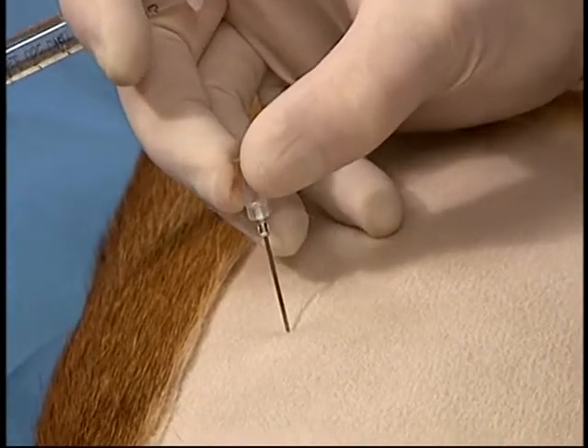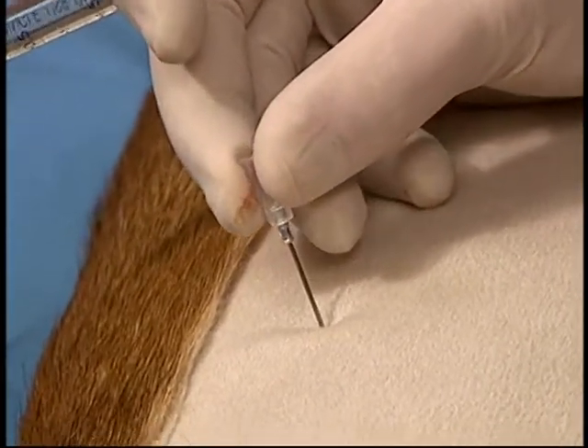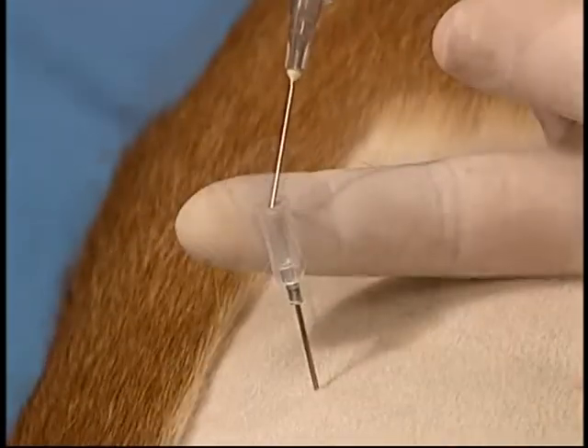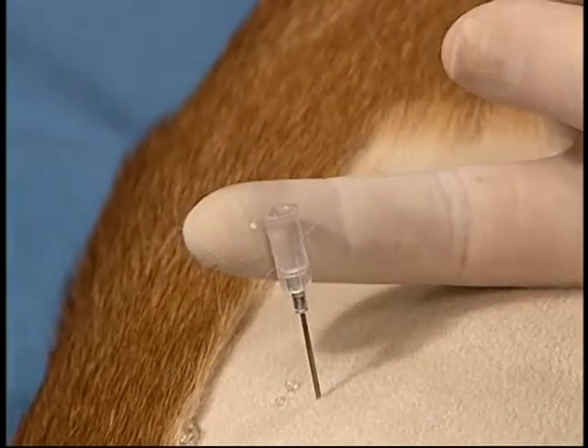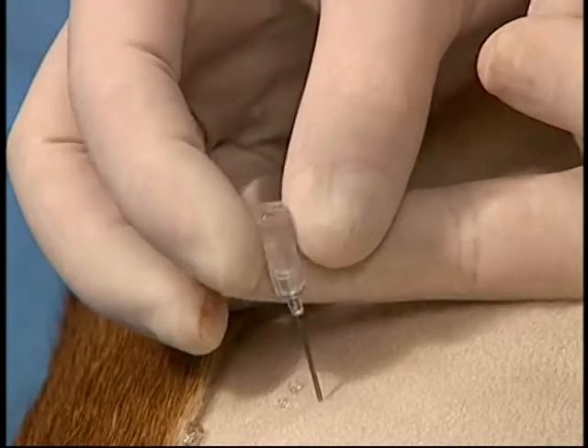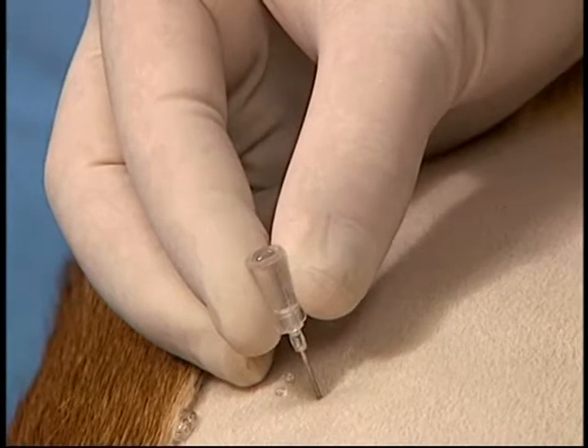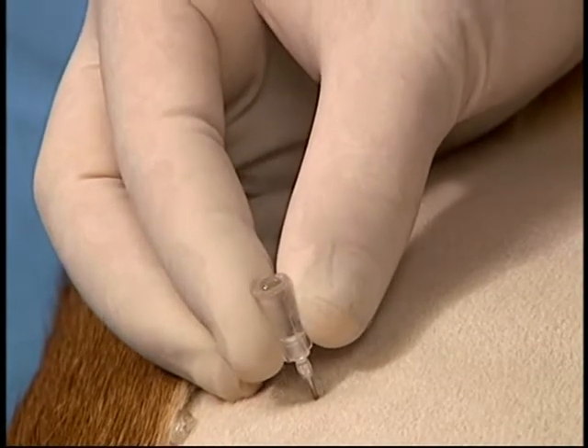If the thoracentesis was negative and there is concern that the needle did not penetrate the pleural space, the needle is placed into the skin and saline is infused into the hub of the needle. The needle is then slowly advanced until the fluid is aspirated into the pleural space. If the fluid is forcibly ejected, the patient has a tension pneumothorax.